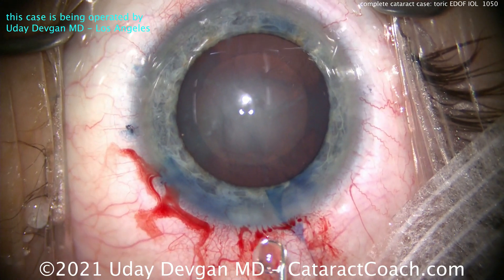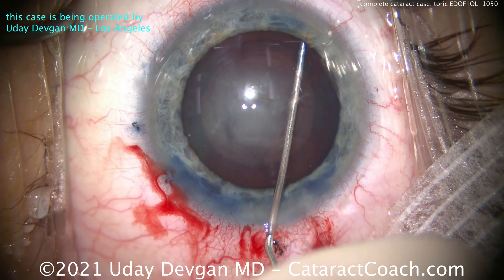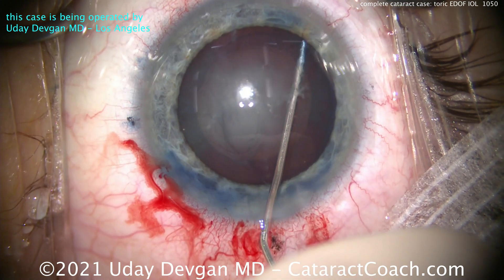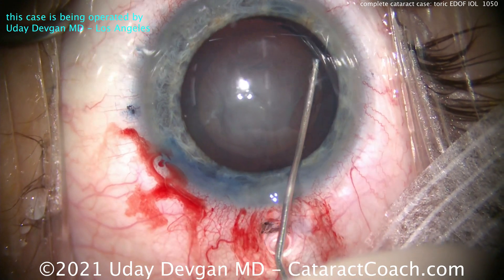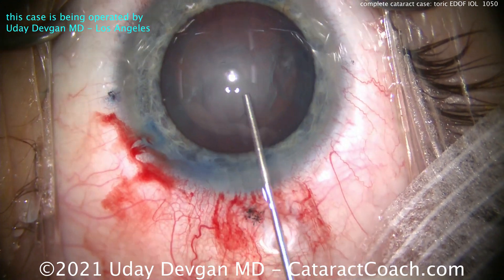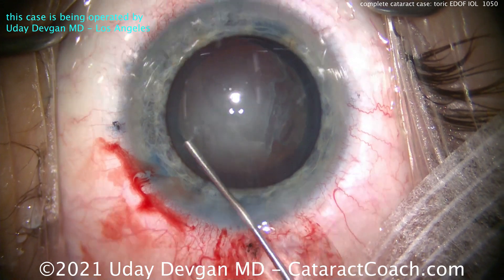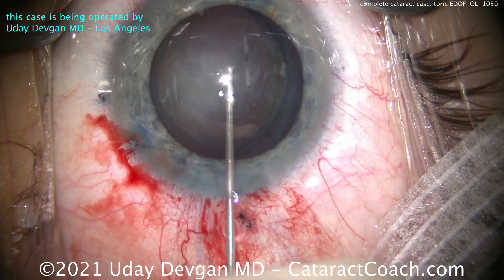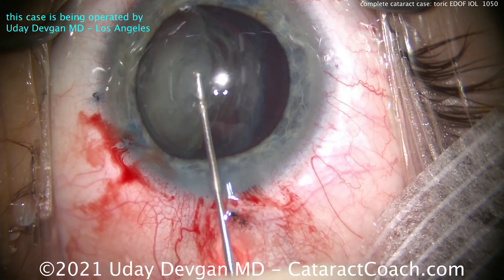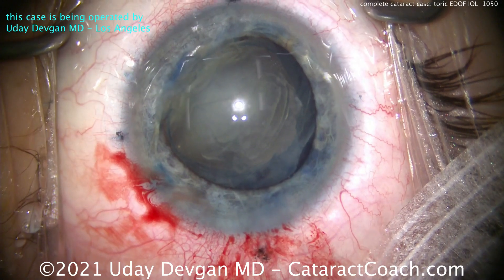The lens is going to be relatively soft — there may be some central nuclear density but most of the lens is soft. Hydrodissection, nice and gently, just using balanced salt solution on a 27-gauge blunt cannula. You want to prolapse that nucleus partially out of the capsular bag, so taking our time here, sending those fluid waves around. Once you get that nucleus partially out of the bag it gives you a little wider margin of safety. There's the dense endonucleus — that's the only part that has any density to it.